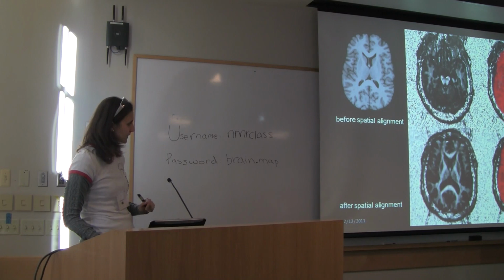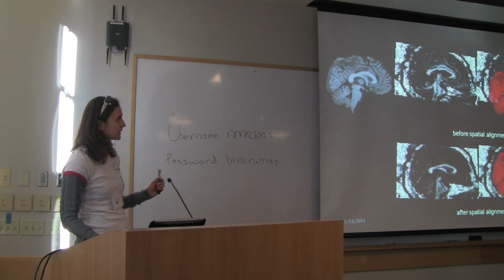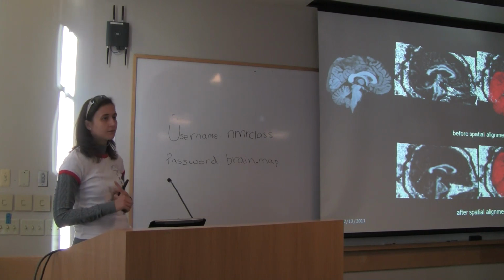The same demonstration, just in another view. Again, before spatial alignment, after spatial alignment, before and after. In this scenario, it was sufficient to use just 6 degrees of freedom. We are using the same subject. The acquisitions were taken on the same day.